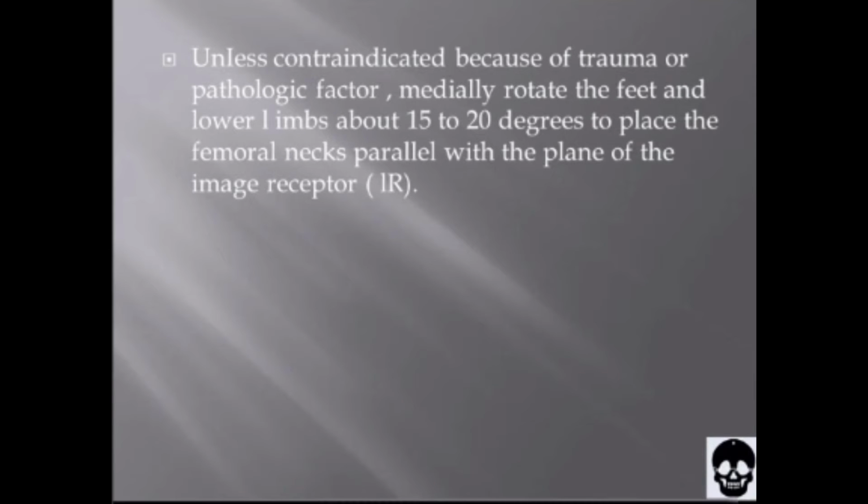Unless contraindicated because of trauma or pathologic factor, medially rotate the feet and lower limbs about 15 to 20 degrees to place the femoral neck parallel with the plane of the image receptor. Medial rotation is easier for the patient to maintain if the knees are supported. The heels should be placed about 8 to 10 inches or 20 to 24 centimeters apart.